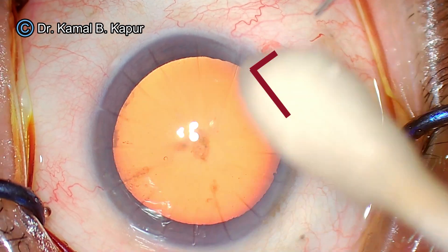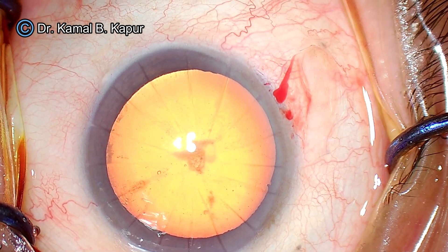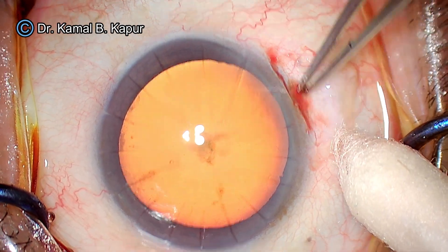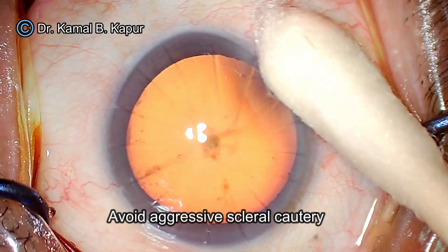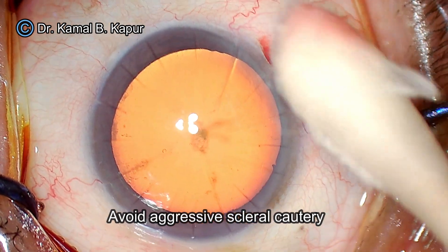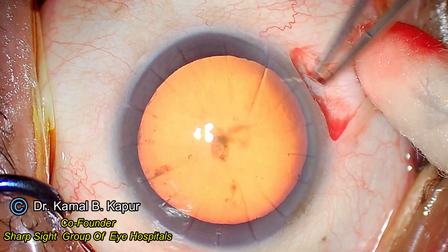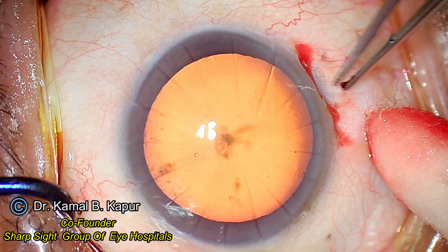Another point to be noted is that we do not do aggressive cauterization of the sclera, especially the peripheral sclera, because excessive cauterization may cause thinning and necrosis of the sclera with exposure of the uvea. Gentle cauterization using approximately 20 to 30 percent of your cautery machine is sometimes enough.